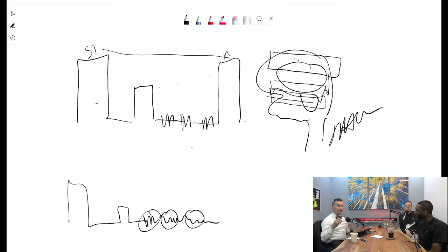For instance, time of flight 3Ds in my mind take 5 minutes, 5.5 minutes or whatever. But with these segments, it's taken me 3.5 minutes. It's just free money. So if you have no compressed sensing, none of that extra stuff? I'm still on the fence when it comes to compressed sensing, especially because it's really guessing at a lot of data.